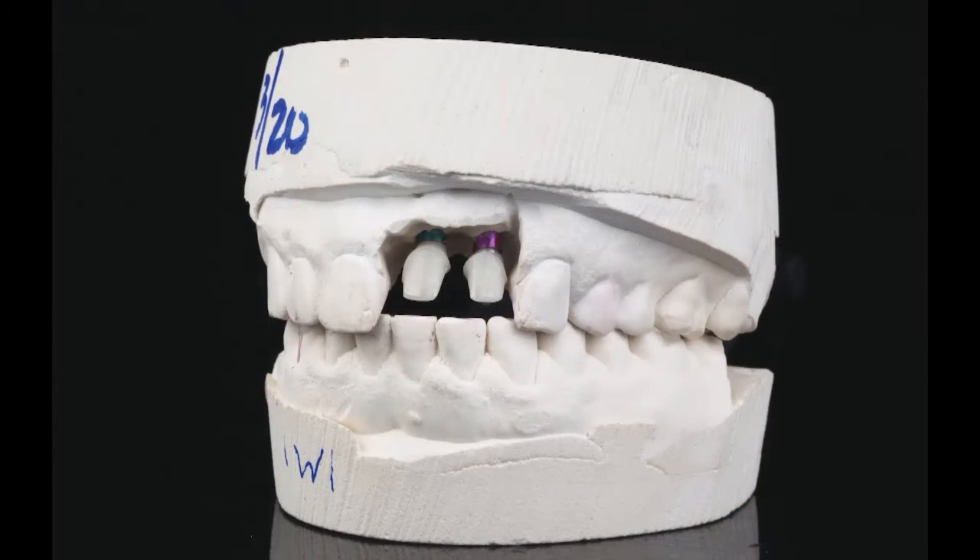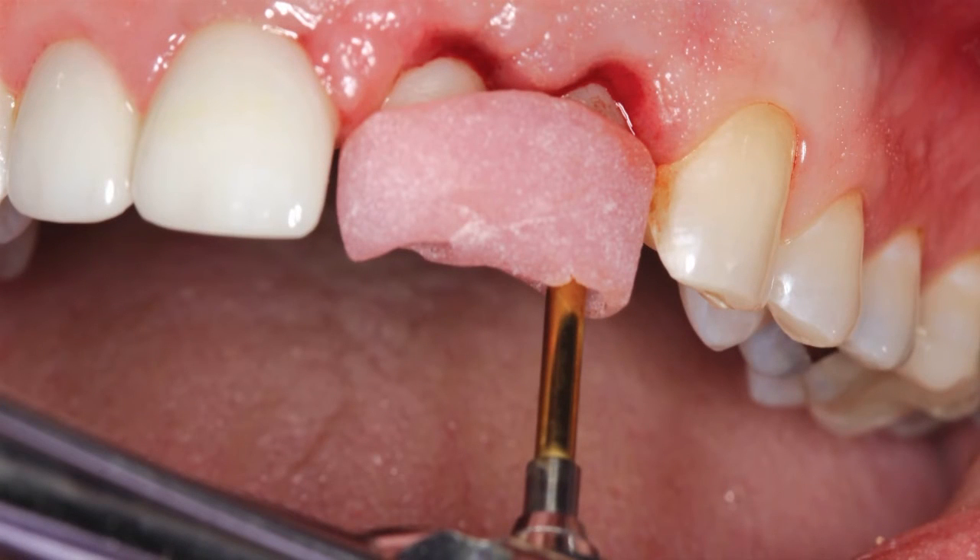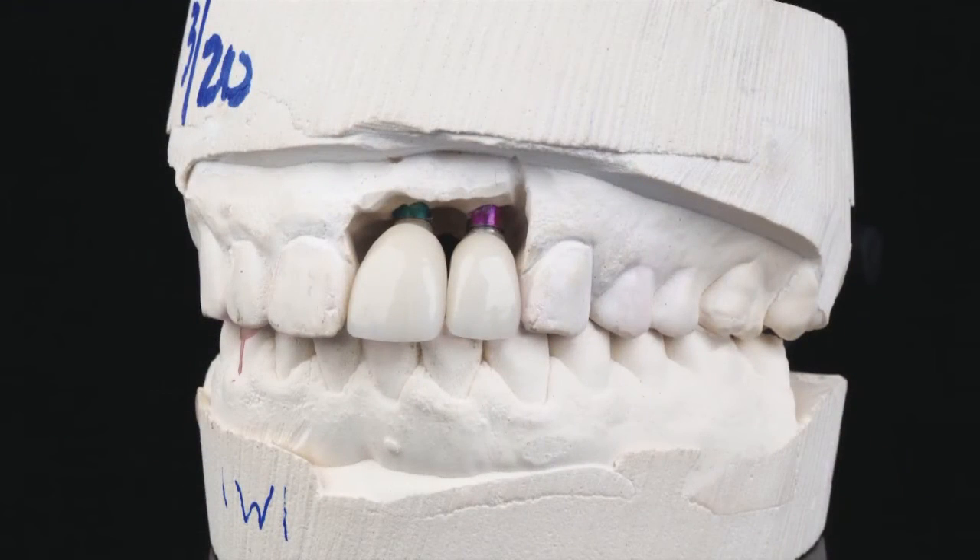Inclusive zirconia custom abutments were produced by the lab, maintaining ideal soft tissue contours and emergence profile. A seating jig helped keep the abutments stable while the prosthetic screws were torqued into final seating, which is critical for meeting the aesthetic desires of the patient. Bruxer anterior material, a monolithic zirconia material specifically formulated for the smile zone, was chosen for the final restoration because of its strength and lifelike aesthetics. The all-ceramic material exhibits long-term durability and natural translucency, especially in combination with zirconia hybrid abutments.